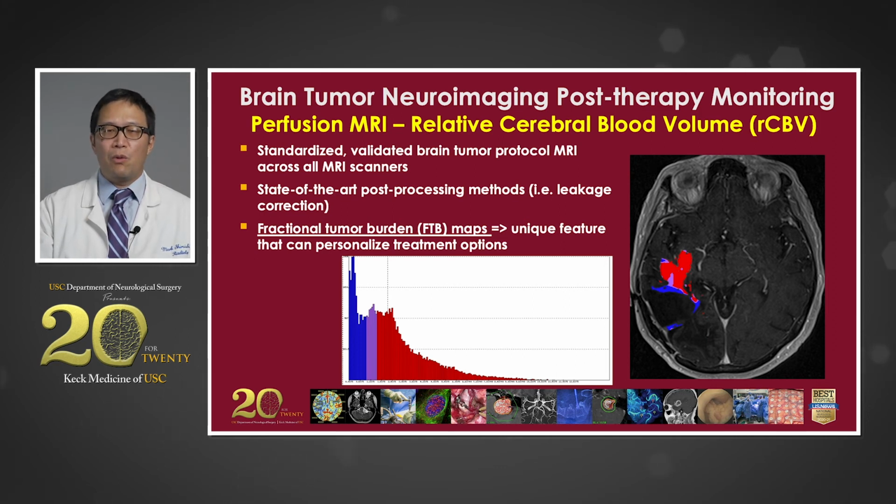And so when we talk to our radiation oncology and neurosurgical colleagues, we're better able to tell them, look, this is not all tumor. There's some of it around the posterior margin, especially around the resection cavity, that looks like it's post-treatment radiation effect. However, if you're contemplating further surgery or radiation therapy, you really need to concentrate on that anterior aspect there. And this can give you higher confidence and really personalize the therapeutic approach to each patient instead of just treating the whole thing as one entity. You can see that it's quite more complex than that.